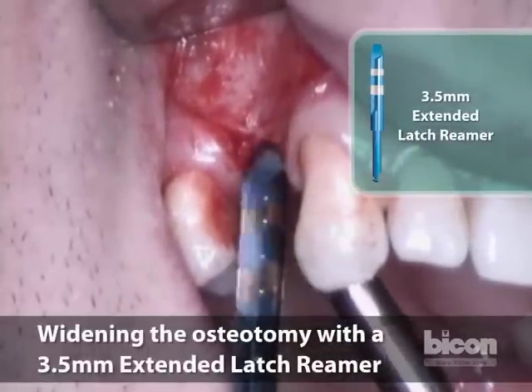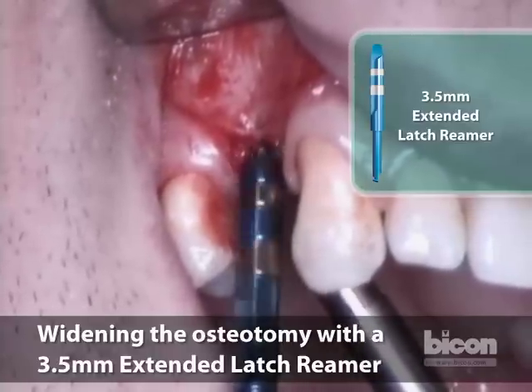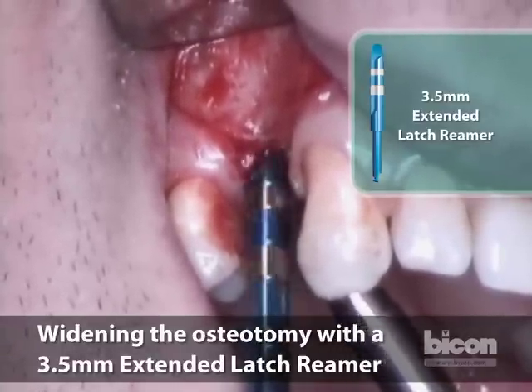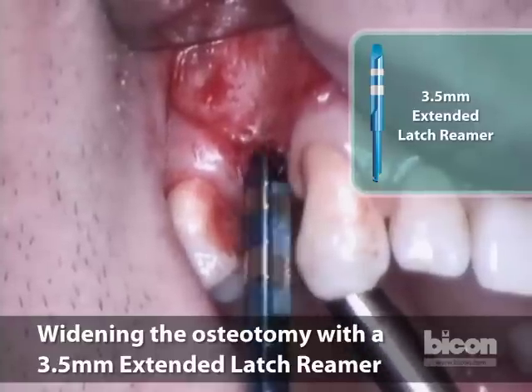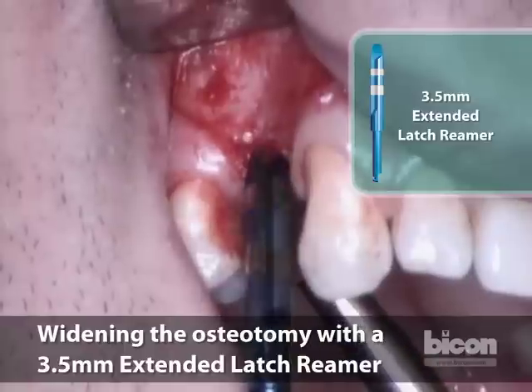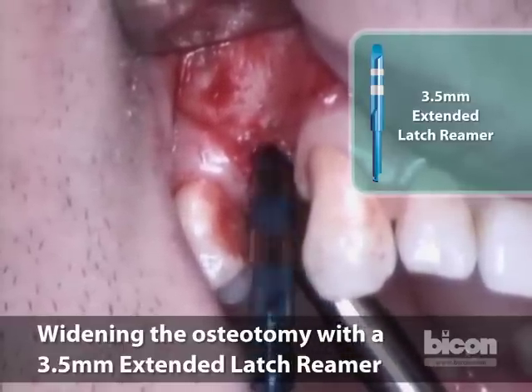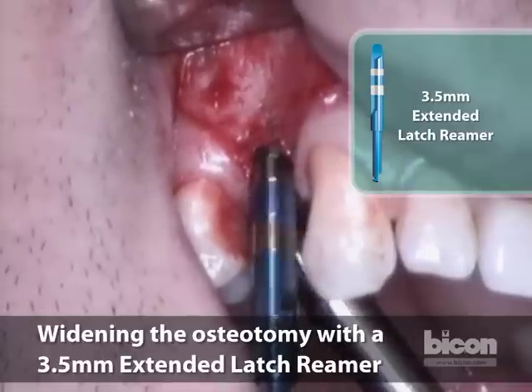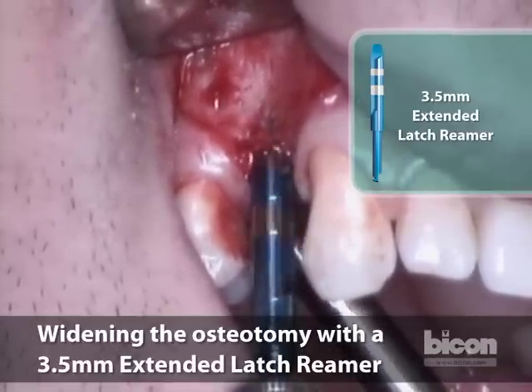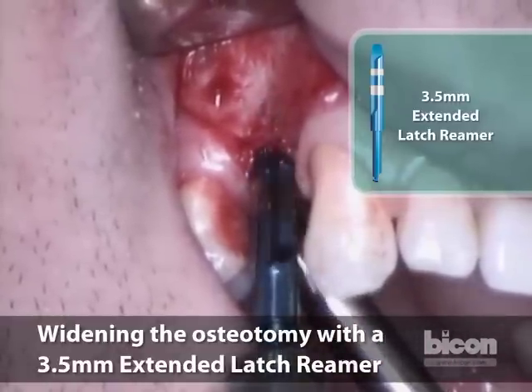This is a crucial reamer because this is the one I use mostly to determine the actual bone density. It is also probably the first size implant I would use in case we want to stop reaming and just place an implant. My goal is to use a 4.5, certainly at least a 4 millimeter implant. We are now at 8 millimeters from the mesial and distal bone — now 6, now 8, and just about 10.